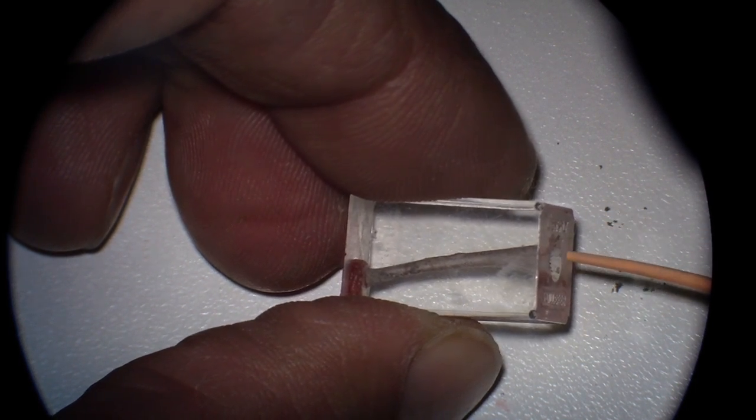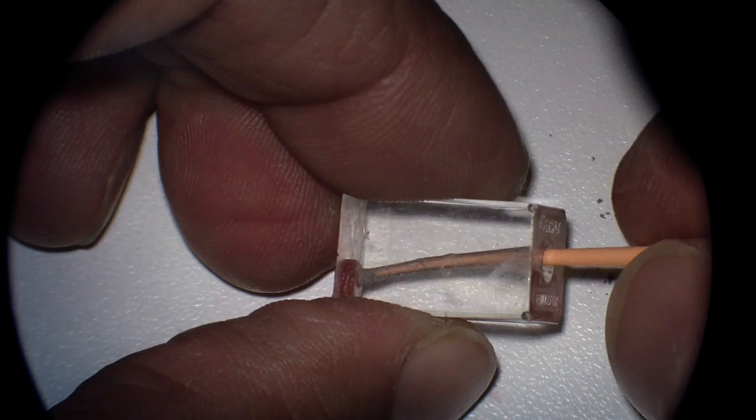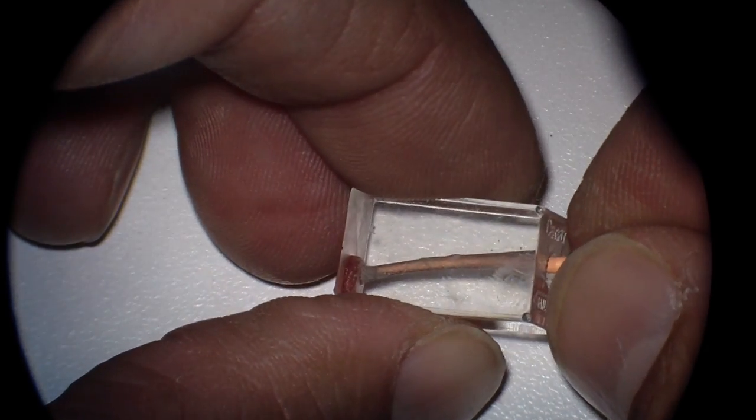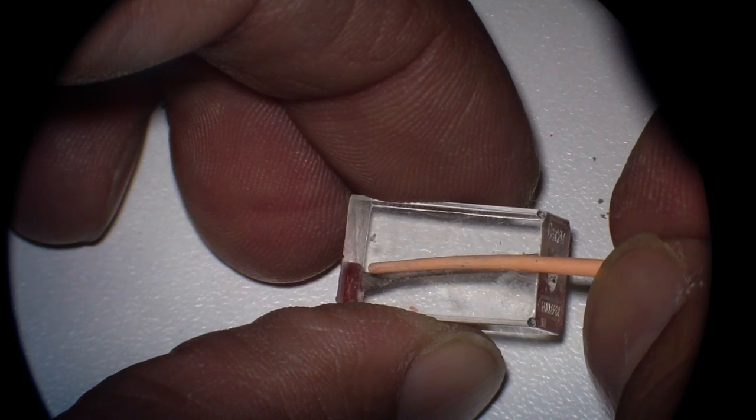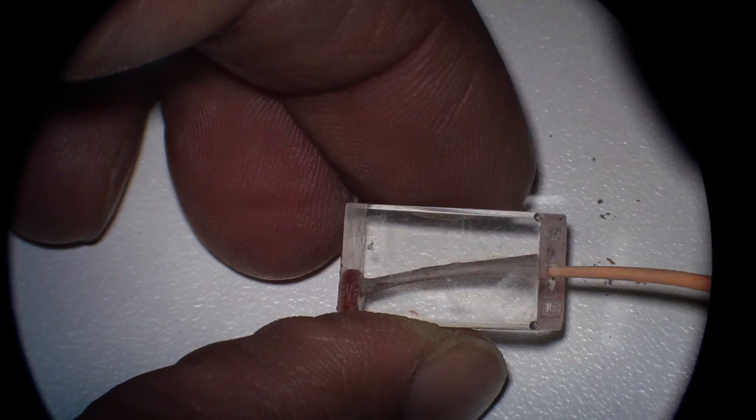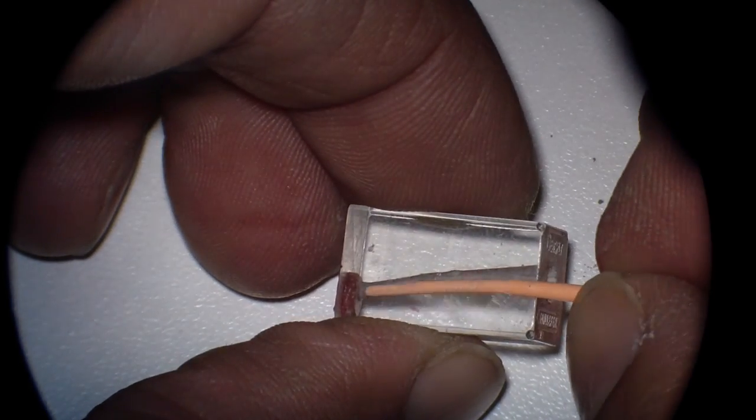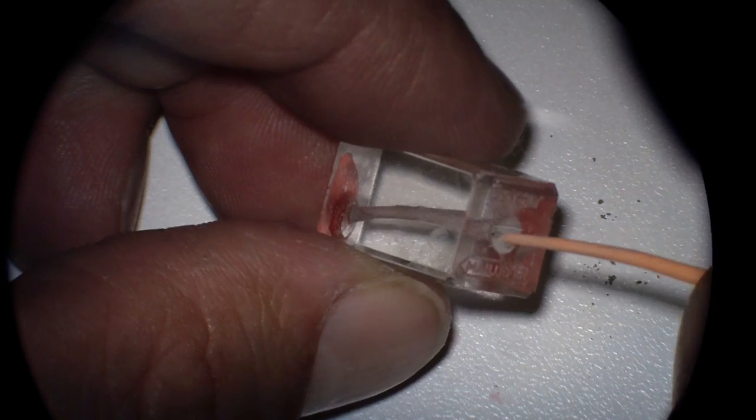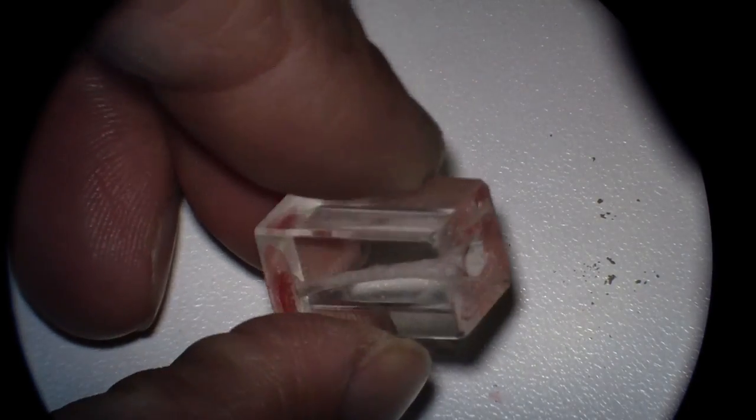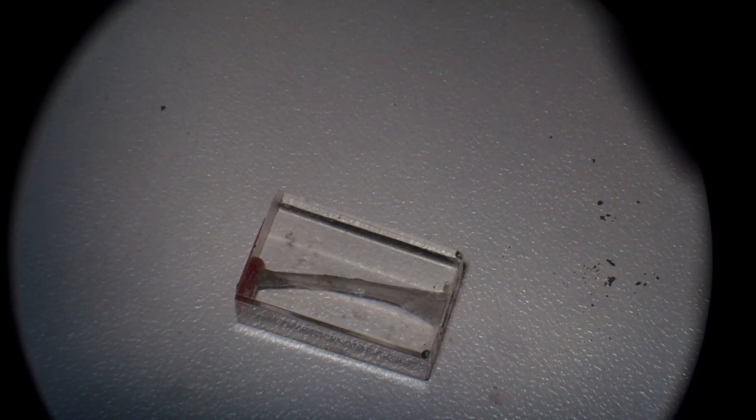Alternatively, you can use the gutta percha point to take that down to the apical portion. Take the MTA, carry it down. Now you can see that everything is going straight. And in this case with that blunderbuss canal, I'm not able to condense this. So we're going to use ultrasonics in a few minutes in an effort to condense all the way around, if you can imagine this down there, as best as possible to get the best condensation, the seal of the MTA.